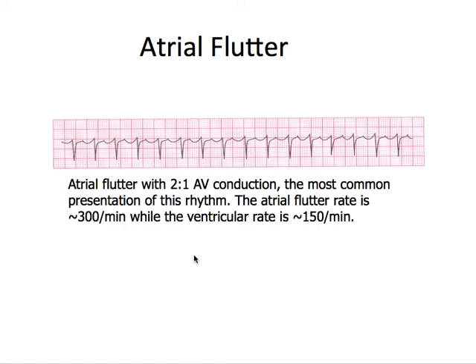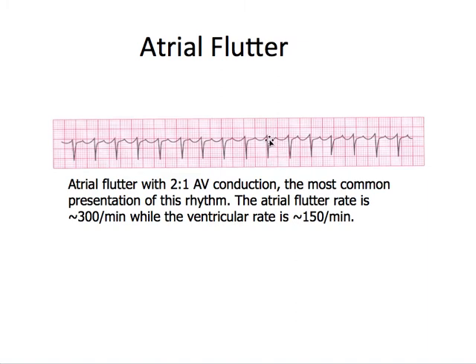Here's a picture of atrial flutter. This has what we call 2-to-1 AV conduction, where there are two P waves for every QRS complex. It's kind of difficult to see in this lead, but we have two P waves here in front of every QRS. Its most common presentation is this 2-to-1 AV conduction rate. If you think about cutting the 300 rate in half, you get the ventricular rate of 150. The P wave rate is actually doubled, and that's how they get the 300 marker.